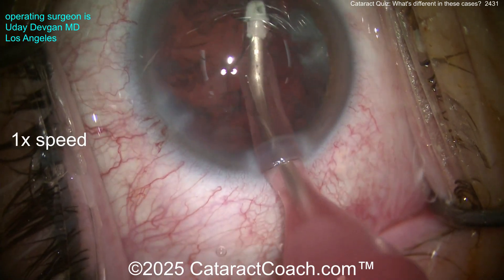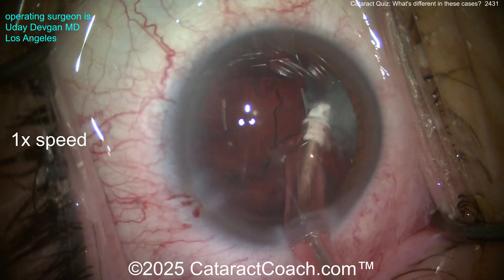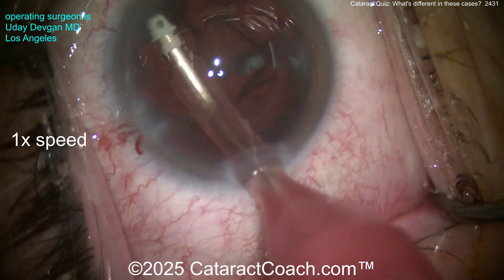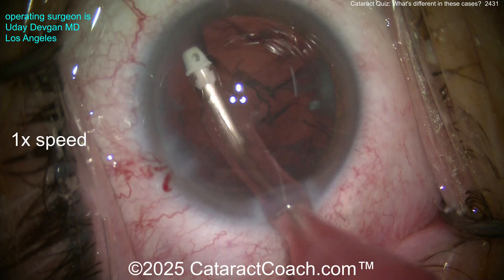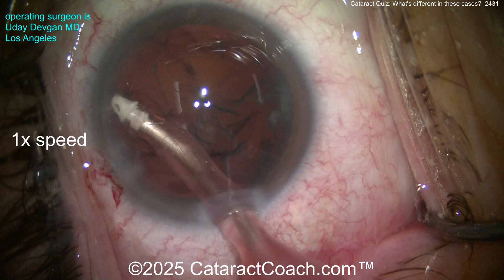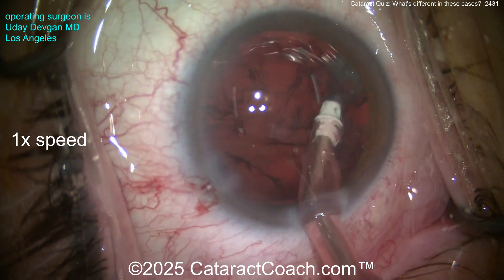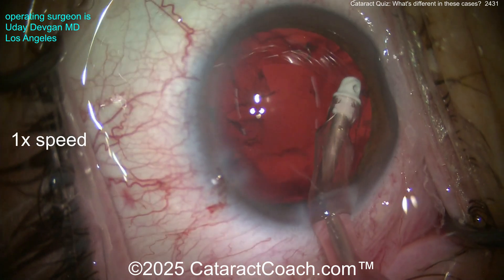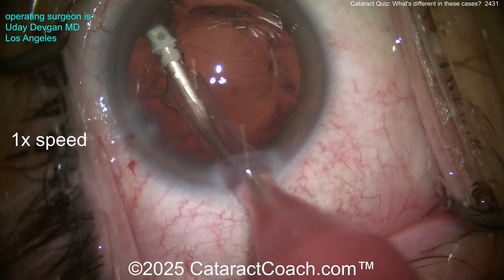Case two — watch this one very carefully. Removing cortex, routine case, normal rexis. Getting out some of the cortex — watch carefully, here comes the quiz. All looks pretty reasonable, taking out the cortex, nice-looking rexis, normal case, no noted zonulopathy. Let's clean up maybe over there a little bit more.